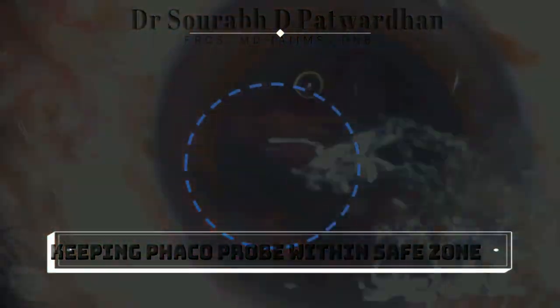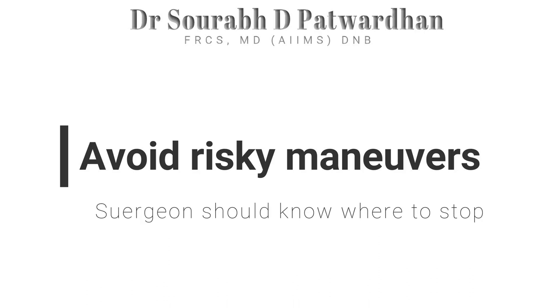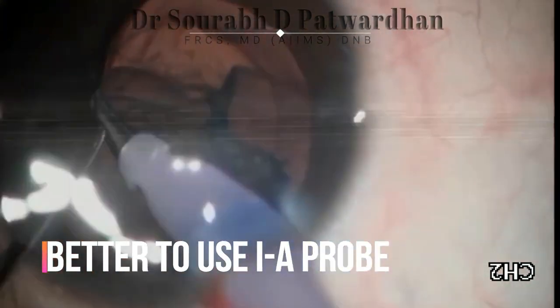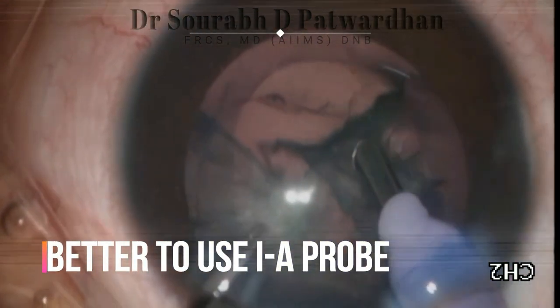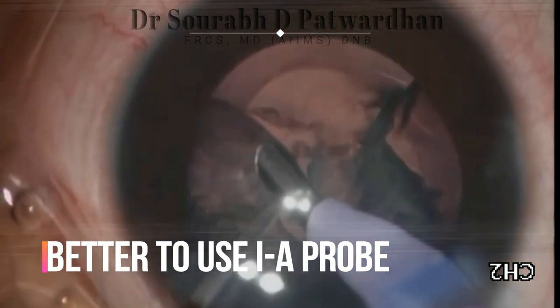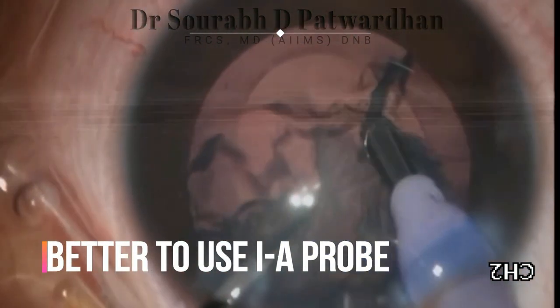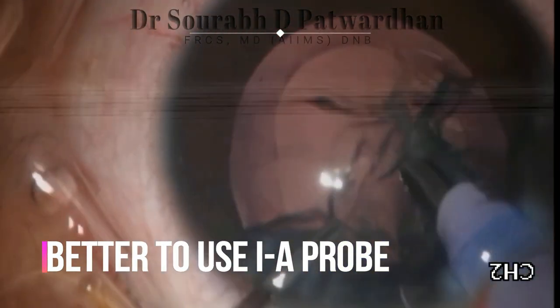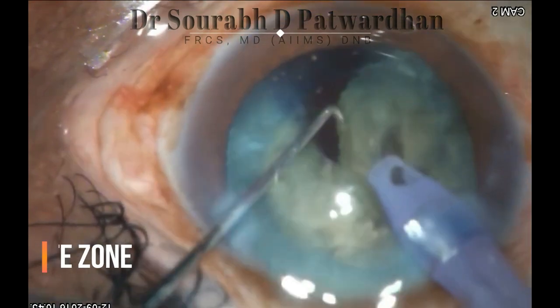Though leaving the safe zone does not necessarily cause a complication every time, we must understand that complication rates are high if you leave the safe zone. Use the IA probe for epinucleus or cortex if you feel that the anterior chamber is not stable. Avoid using the FACO probe for soft cortex or epinucleus if you feel it is risky.